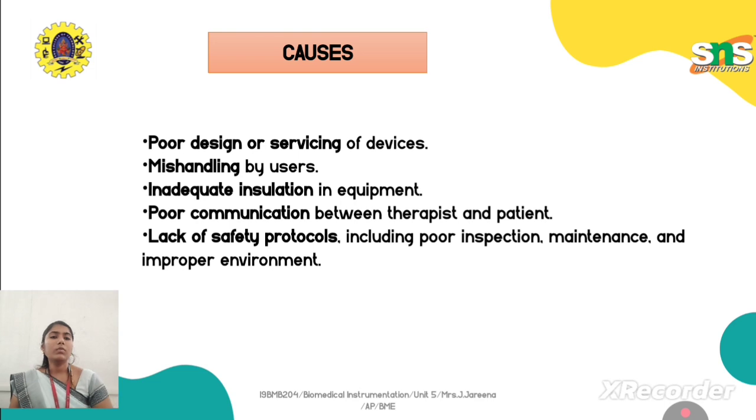Okay, so what are the root causes for this shock? First one is poor design or service of the device. So we have to be very careful and conscious when we are designing the device, by providing proper isolation and proper insulation materials when making the device, and also during service we have to do proper service and follow it periodically. If you are not following this, obviously there will be a high chance for the person to get shock.